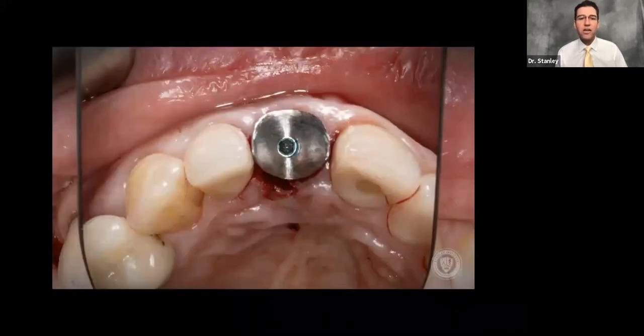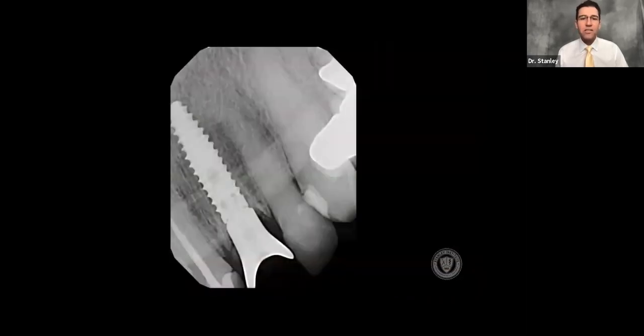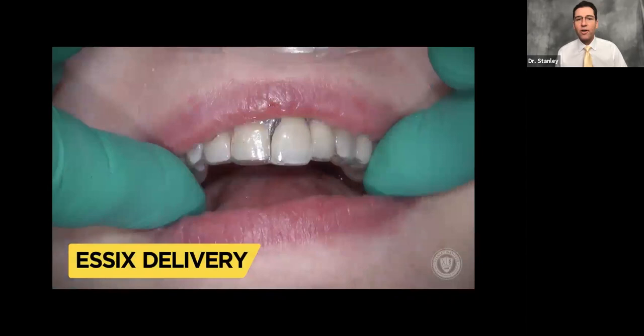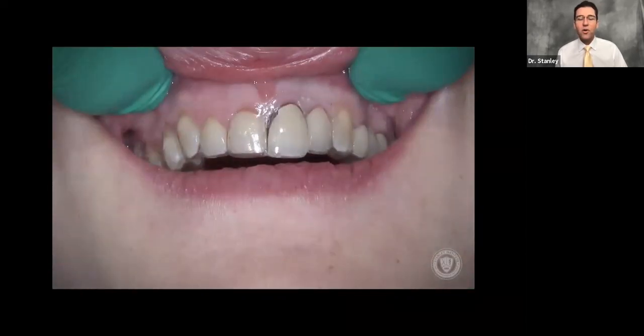From the occlusal, we have a very nicely placed implant with a little gap between the soft tissue and the healing abutment, but note that it matches up nicely with the contralateral central. We've given the patient an Essex to wear during the healing process. That whole process, minus the actual getting the patient numb, usually takes about four to ten minutes, and we get pretty good results.